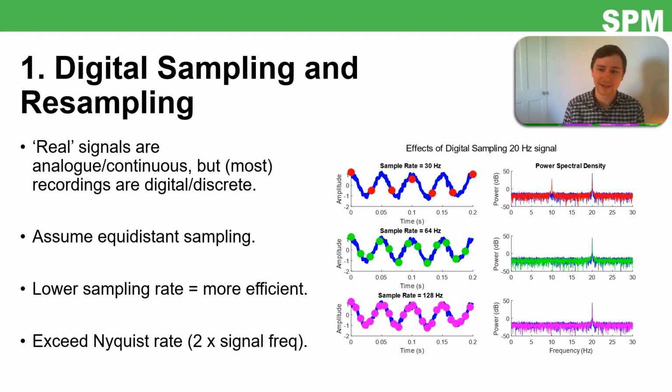I'm only mentioning this because it allows us to talk about hertz. The idea being that the time between each sample should be equivalent throughout your whole recording. You don't want to sample, then 20 milliseconds later do another sample, then 21 milliseconds later another, and then back to 20. It will always be uniform, hopefully. And when I say hertz, that just means samples per second, or the inverse of the time between samples. So 20 hertz, 20 samples per second.